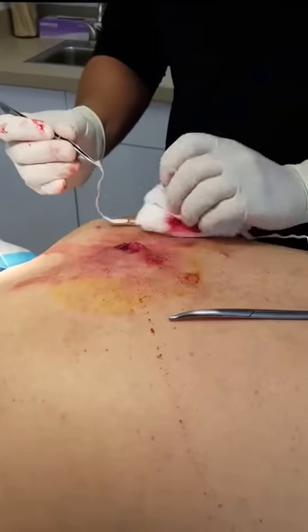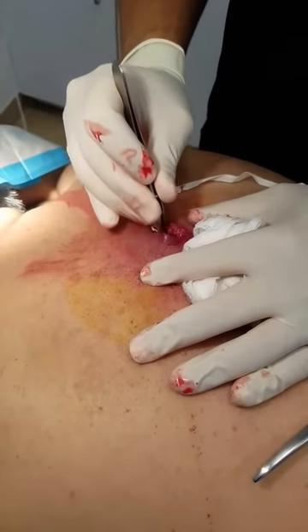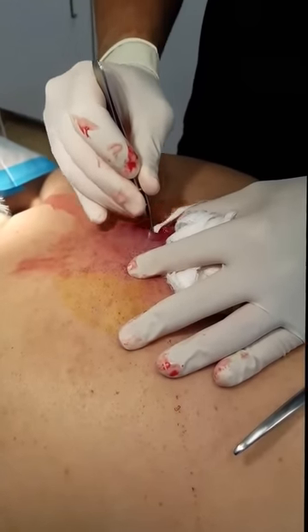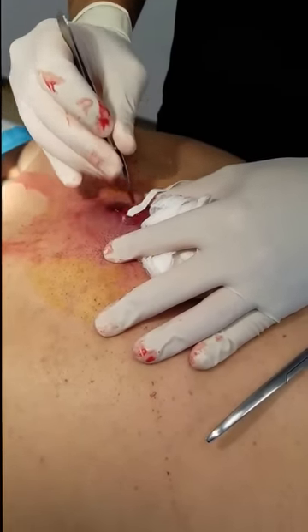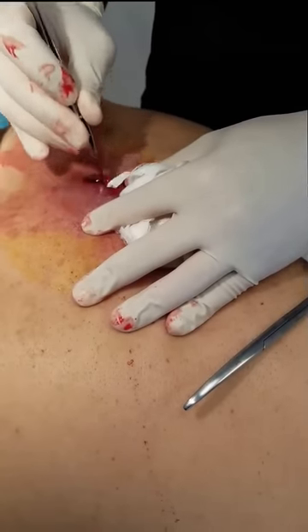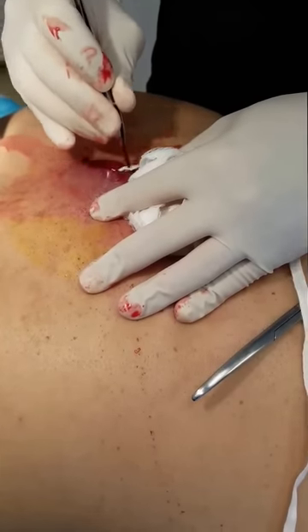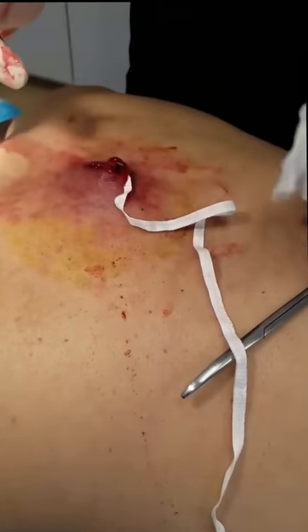You can tell it's very flat now — got quite a bit of the pus out of there. Go ahead and put the packing in there. This is a very large infected area — looked almost like an infected lipoma. I might get even a foot or maybe a foot and a half of packing in here. There's nothing sterile about this procedure but you want to make sure you are wearing sterile gloves. Put the patient on some pain medicine and antibiotics, then follow up in one to two days and we'll go from there.